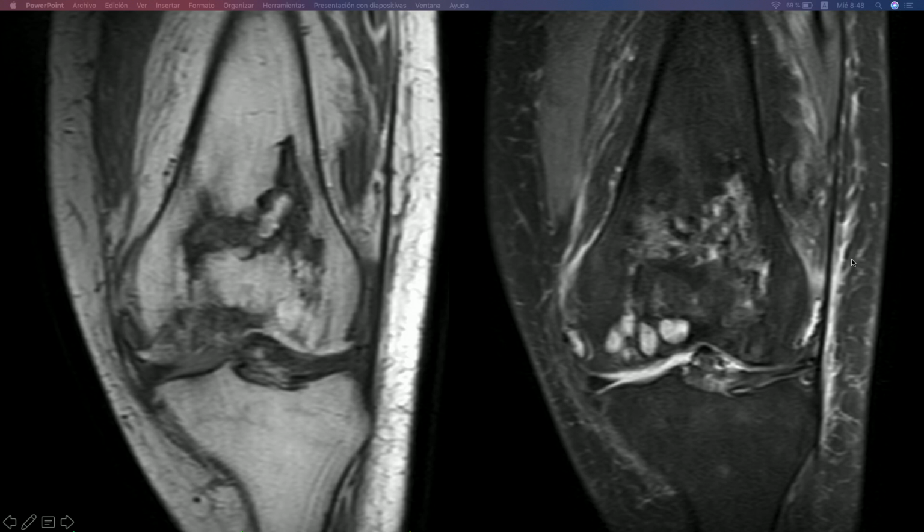An MR was taken, and the T1 and the proton density showed the marginal osteophytes on the femoral condyles and on the tibia. As well, we can see in the proton density the subchondral cysts and the joint effusion. Some cartilage loss. All these were consistent with osteoarthritis. As well, we can see the image that caught our attention in the radiograph.